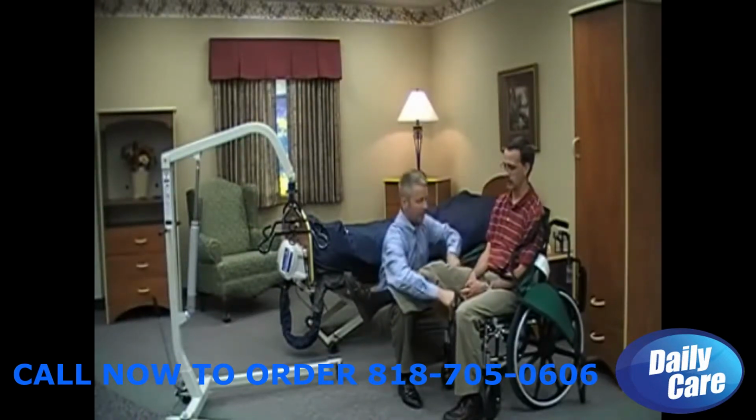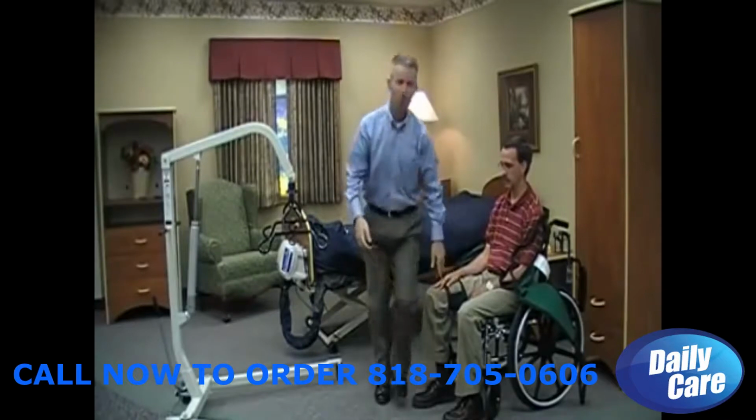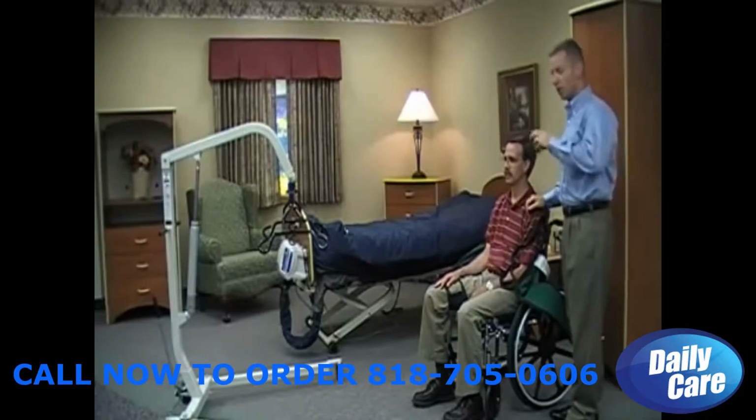Now I'm going to use my hand to move that in place so that we don't create any friction, and once I do that, I'm just going to put the resident's hand there and I'm going to move the other side. Now the other thing that's important to know is, depending on the facility's requirements, either one person or two people may be mandated for doing transfers.